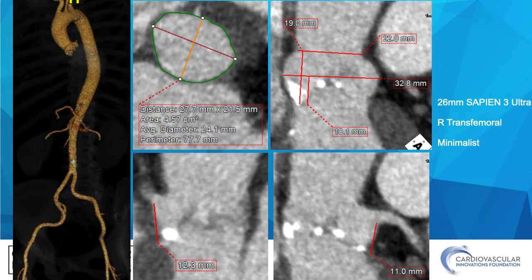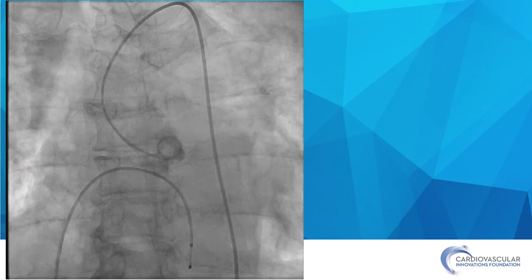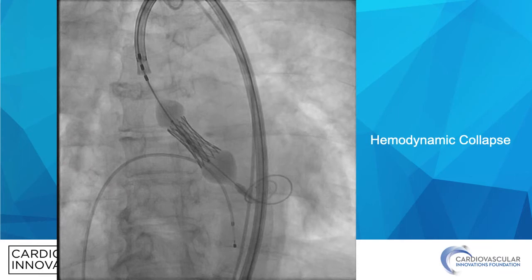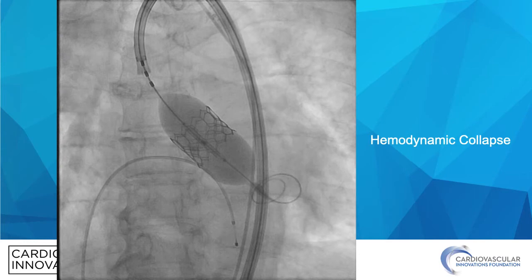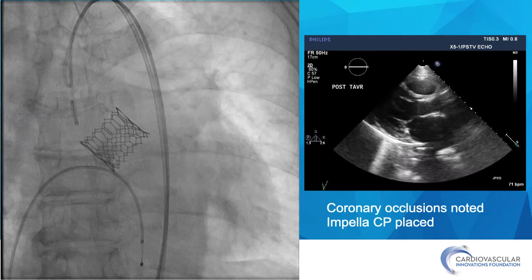The plan was for right transfemoral access with our standard minimalist approach. Here we are finding a coplanar view — nothing unexpected about these initial images. We then proceeded with alignment and deployment of a Sapien III Ultra valve. We did a standard, high-ish deployment, about 85-15 or maybe even 90-10. Immediately after deployment, the patient had hemodynamic collapse and EKG changes.